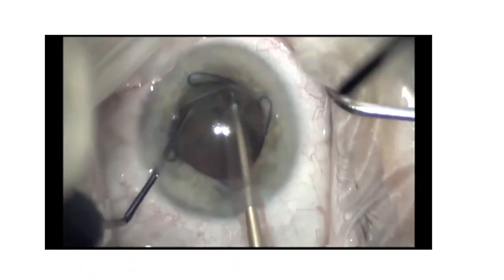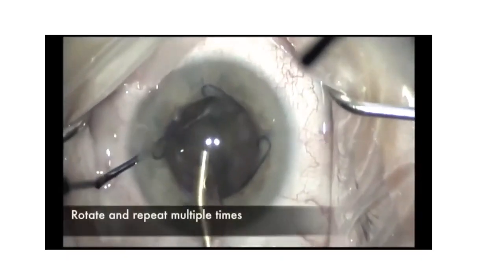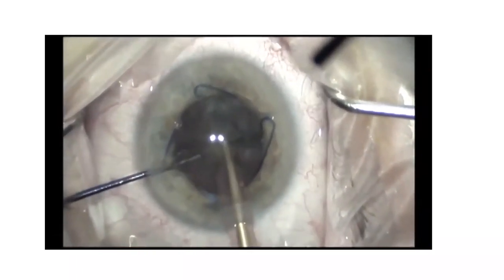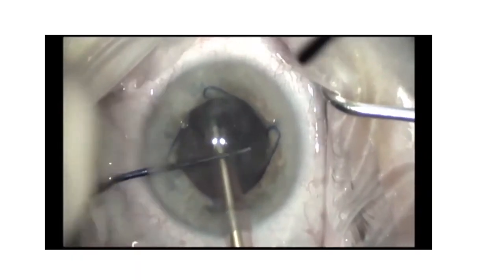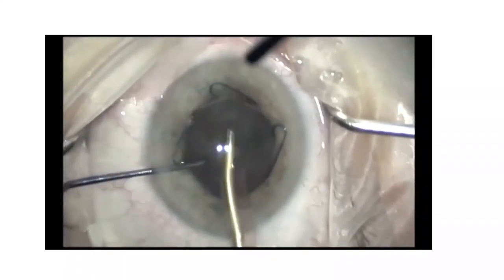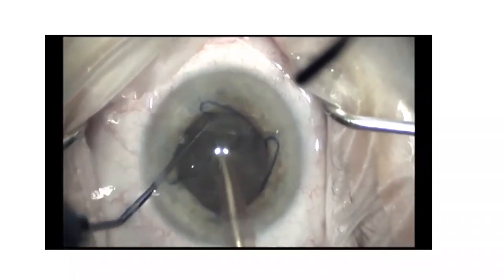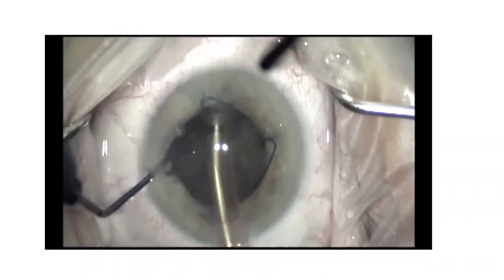So you tailor your technique depending on the case. This is also useful for cases of hard cataract, where you want to divide the nucleus into multiple small pieces without too much stress on the zonule. This is a horizontal. So he did a combination between horizontal and vertical chopping.